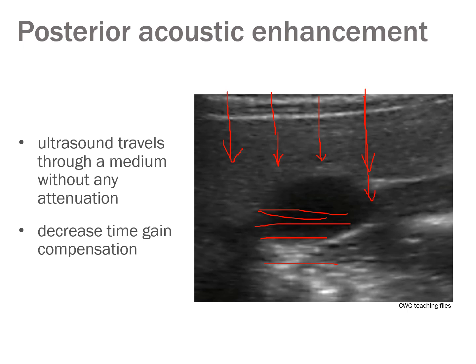Whereas the stuff that's been traveling through at the sides is getting attenuated by passing through all the tissues in front of it, so it has less energy by the time it gets to this same level, and it appears dark. The reality of it is that by understanding artifacts, you would know that this tissue here is all the same, and there's just been a posterior acoustic enhancement, because some of the sound has more energy than others based on what it's passed through already.